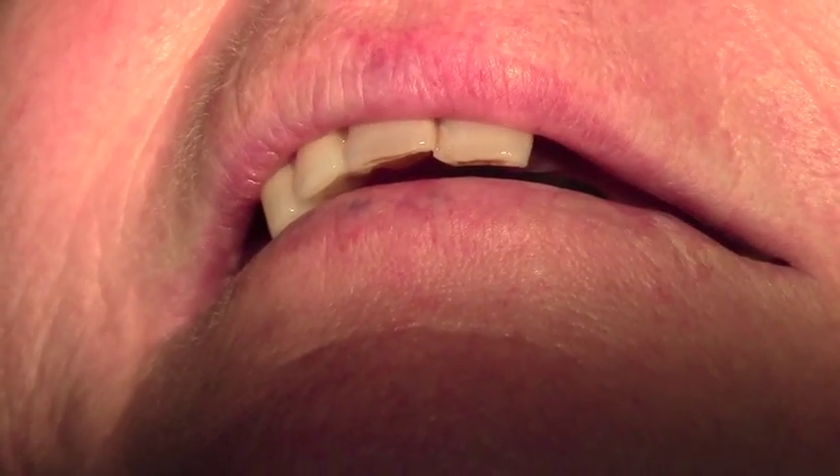Today we're doing a metal try-in of two bridges — the right side supported by two dental implants, and the left side supported by two dental implants. The abutments for this are the new Atlantis CAD-CAM abutments with a metal substructure for try-in.